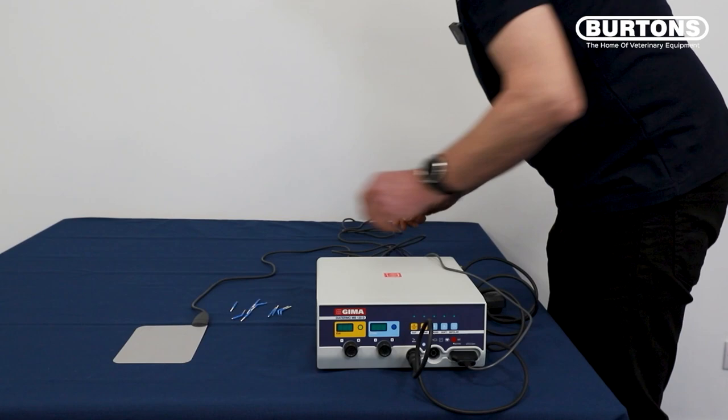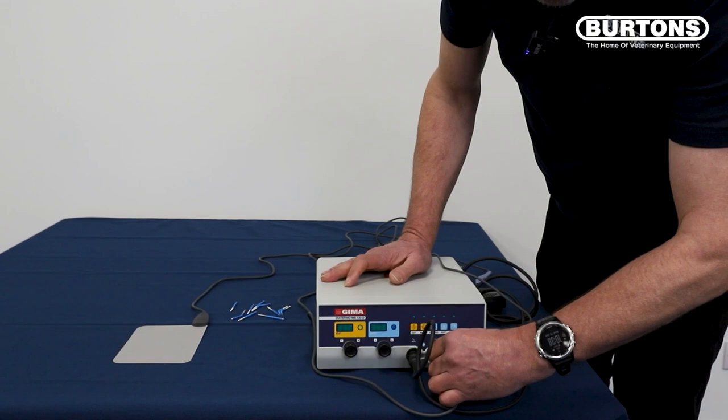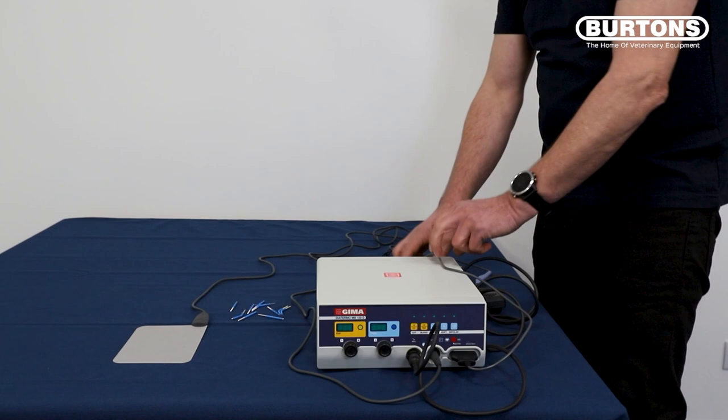And then we have the grounding plate, and that pushes into the only hole that's left, into there like that.